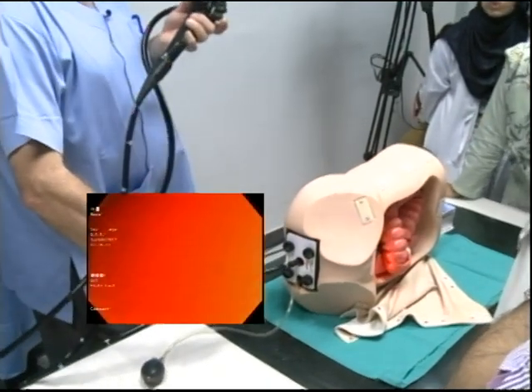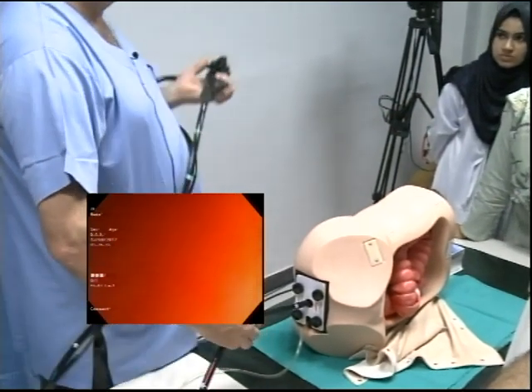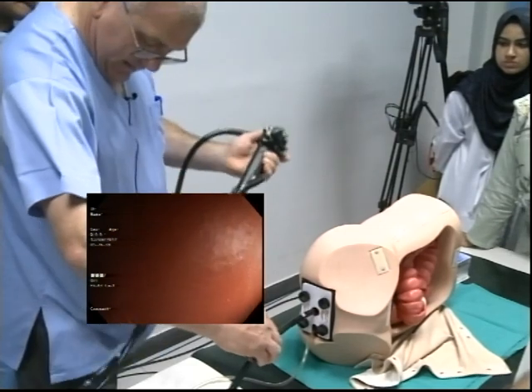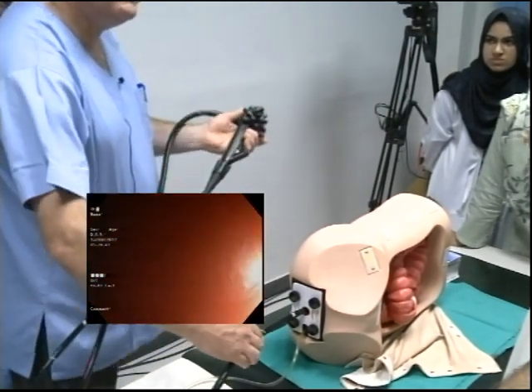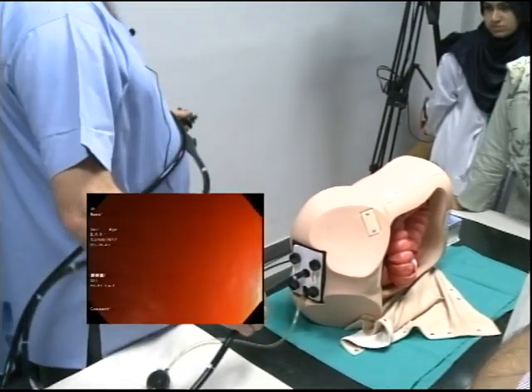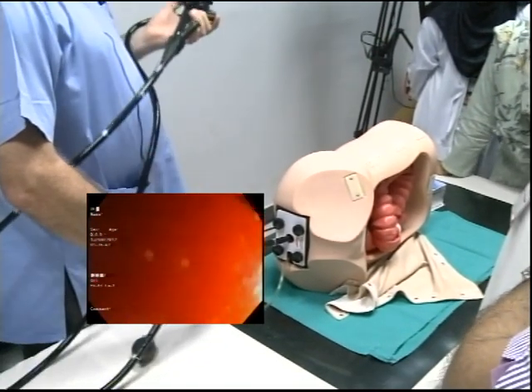This is a mannequin, so you don't need to put too much air in. So when you're coming around, can you see the scope? It's trapped under. See there? And a lot of it, it's stiff. It's how you got the scope. I knew it was that, so pull the scope forward, keep it still, and allow the scope to come round.